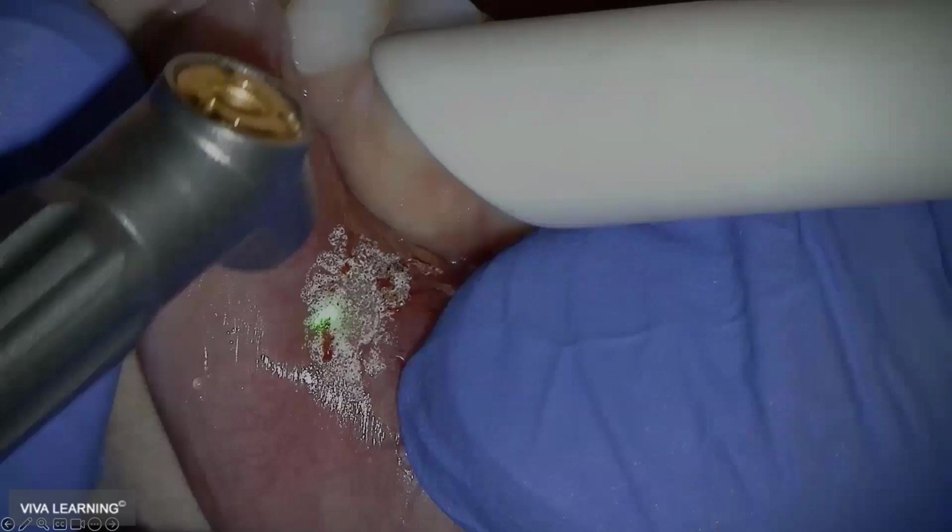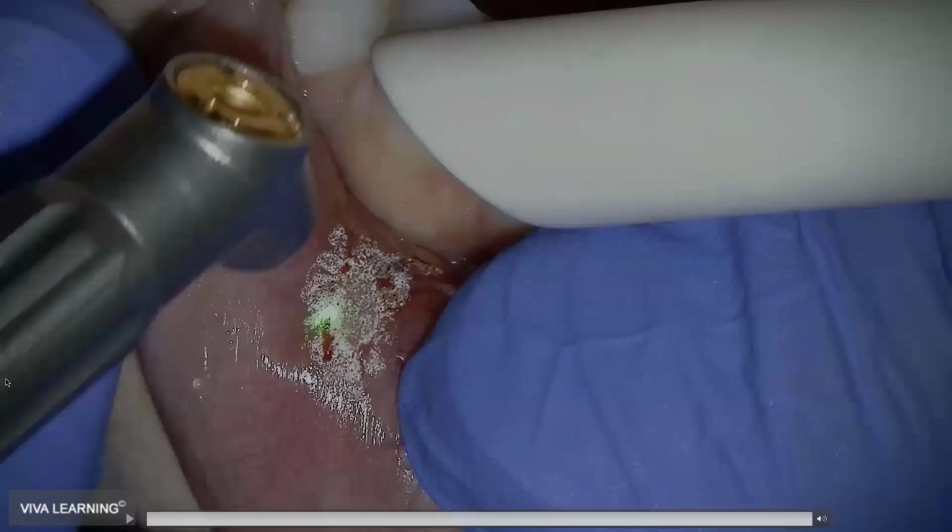One question that just came in: what CDT code do I use for that? Basically, you can either do it as a palliative treatment or destruction of lesion. That's another one that we'll use sometimes. Sometimes we'll even bury it in a 0140, just part of the exam, because as you saw, look how long this takes, right? To do that.